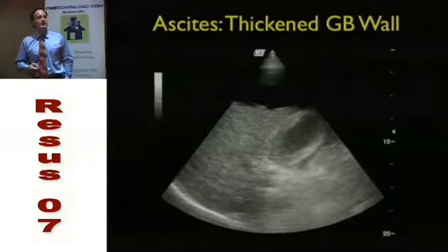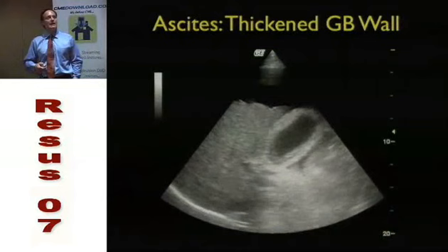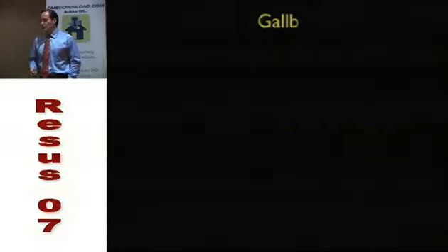And look at this clip. Now, this is a patient who had liver disease, right? What's all this, guys, right up here? That's all ascites, right? And there you can see the thickened gallbladder wall, but notice that there's a lack of gallstones there. Okay? One last pearl.